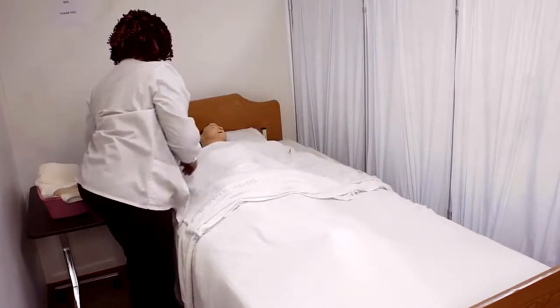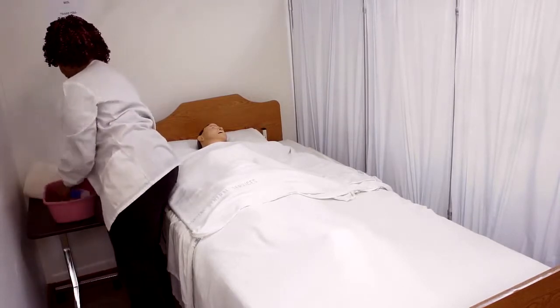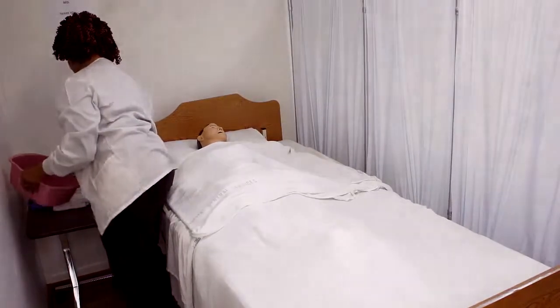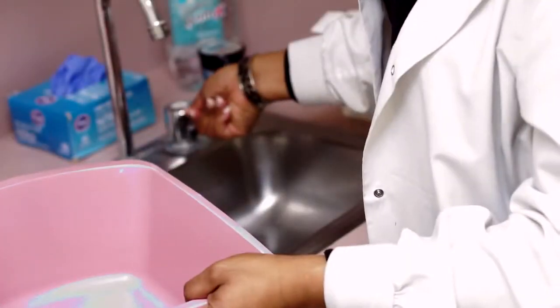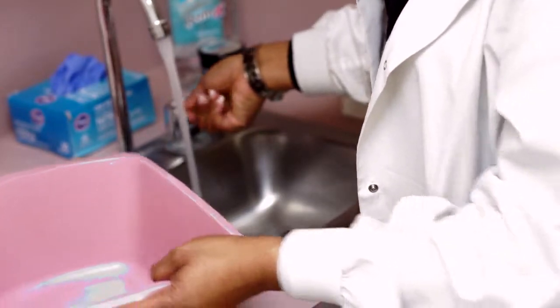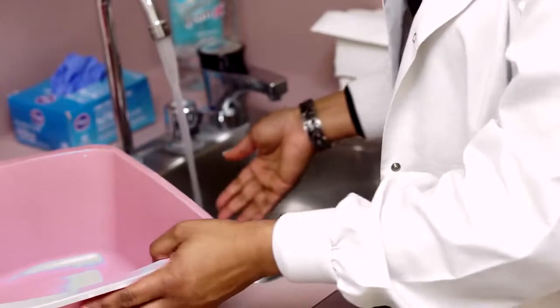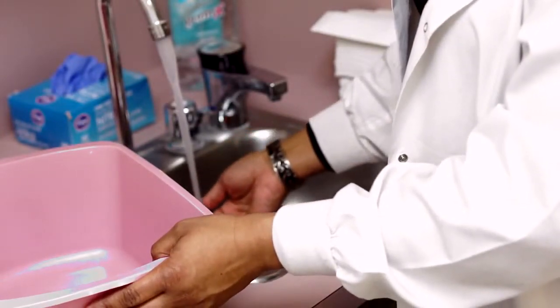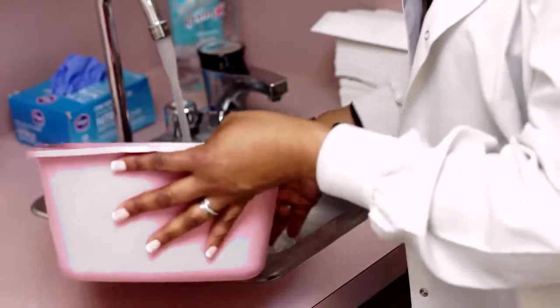You don't want it to be up against you, so be careful about that. Okay. All right, Mrs. Johnson, I'm going to go ahead and take my supplies out. I'll go wash my hands and get water for you, and I'll be right back. So we go out, we walk to the sink, go ahead and turn the water on. We simulate washing hands for the purposes of state. You want to test the water, make sure it's not too hot, not too cold, no more than 105 degrees for the patient, so we don't burn them.